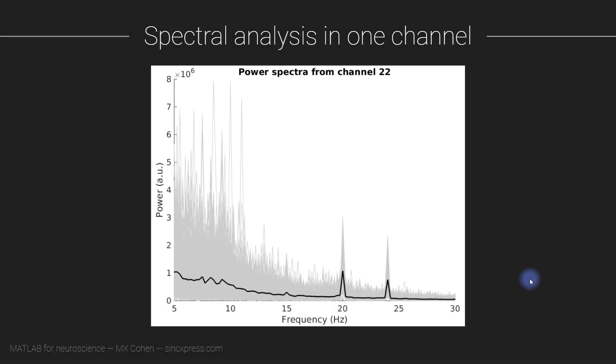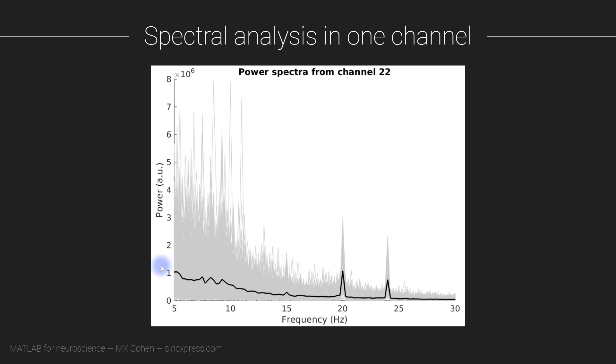Now we are going to perform a spectral analysis on the data from one channel. This is the plot that we are going to be working towards in this video. Let's first focus on this thick black line here. This looks a bit similar to the power spectrum I showed in the first video of this module. You see decreasing power with increasing frequency, and you also see two prominent peaks at 20 hertz and 24 hertz, corresponding to two of the stimulus flicker frequencies that were closest to the middle of the screen.